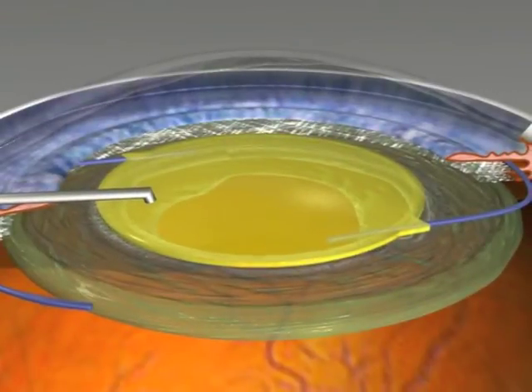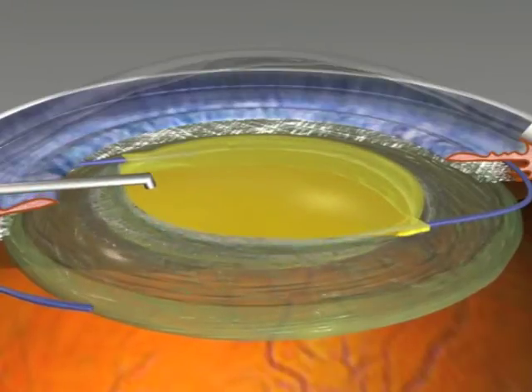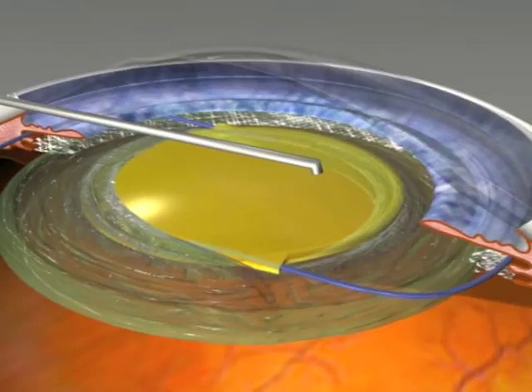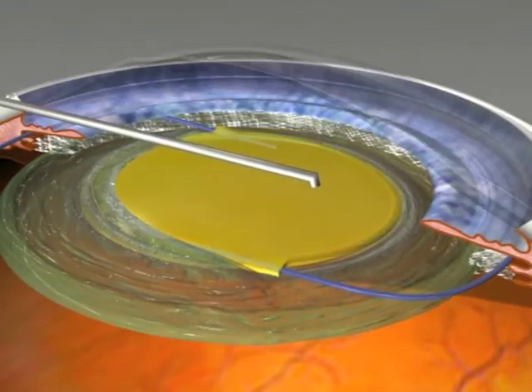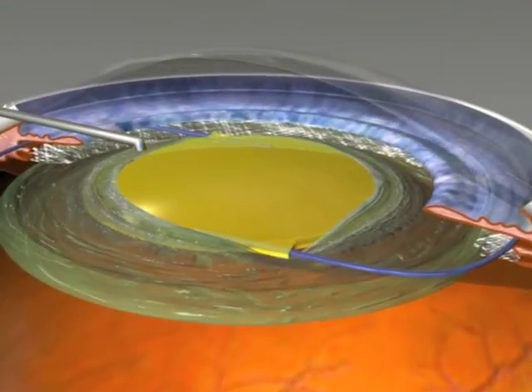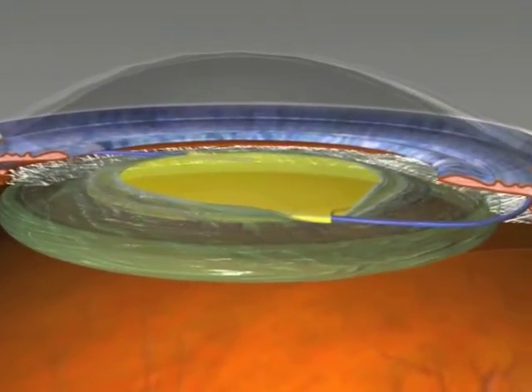To manage loose sulcus IOLs I make an opening in the membrane if there's not one there already to be able to use optic capture. Sometimes there's a PC opening that one has to enlarge appropriately to achieve optic capture.